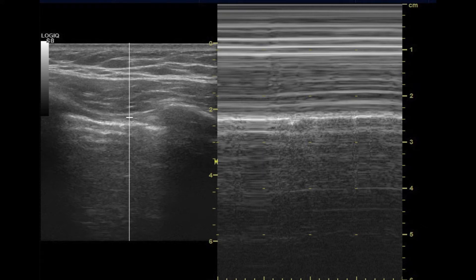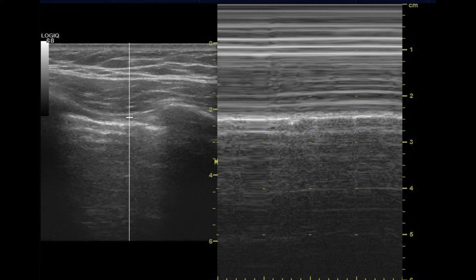Lung sliding can be documented in M-mode. Place the M-mode caliper through the interspace — not over the rib. The granular texture below the pleural line represents movement of the lung, and the linear appearance above represents the lack of movement in the chest wall. This is called the sandy beach sign, where the lung tissue is the sand. The chest wall shows a striated or linear appearance because things aren't moving much, giving us the waves of the sea in the chest wall and the sand of the beach from the moving lung tissue.